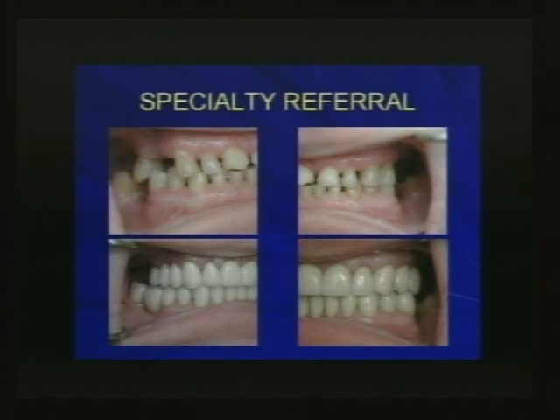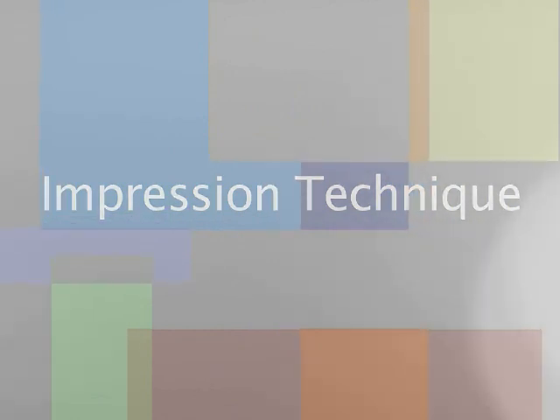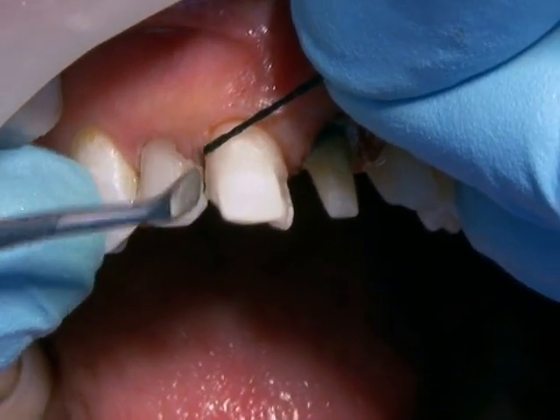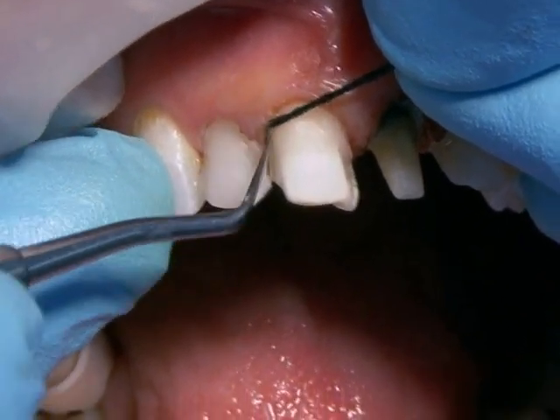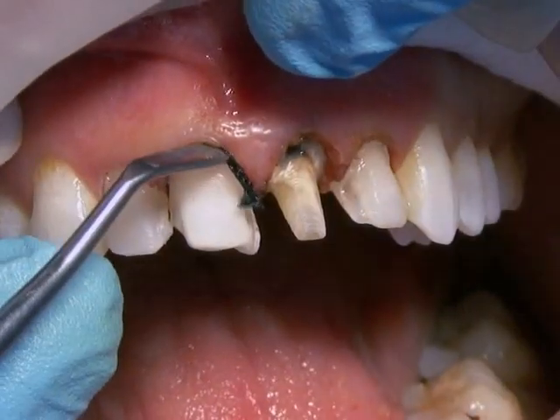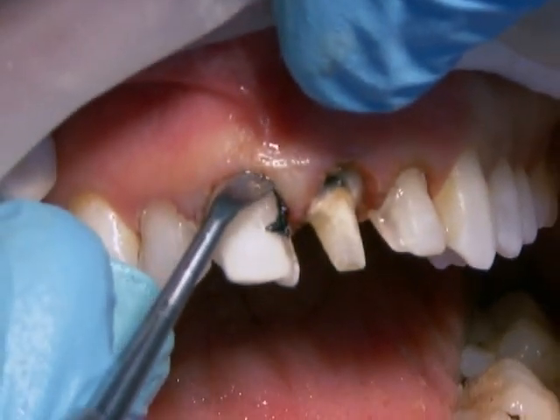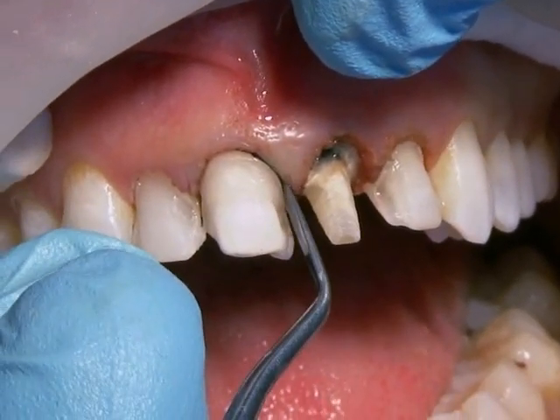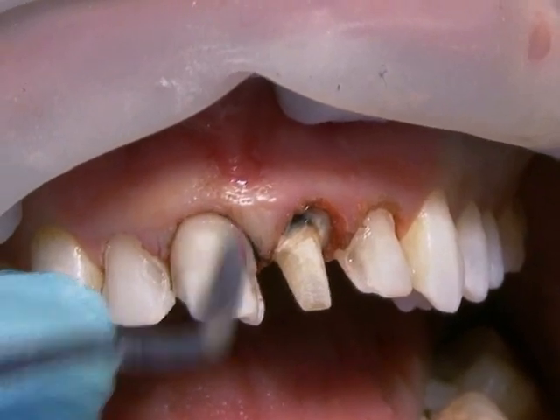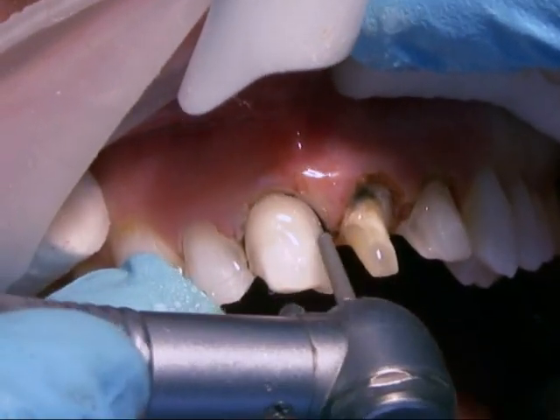We are packing a triple-O cord into the tissue. This has already had laser troughing and recontouring to make the teeth appear longer. We're placing one piece of triple-O cord around the central and left central. After placement, the cord should sit for about four minutes, then we can pull the cords. While waiting, we'll do some minor refinement of the preparation, because that may drop your margin slightly.